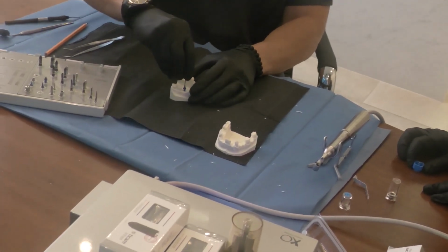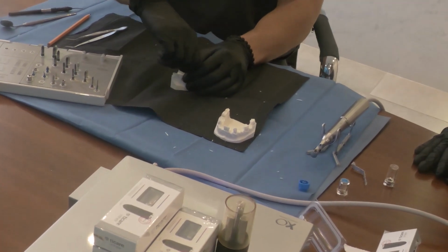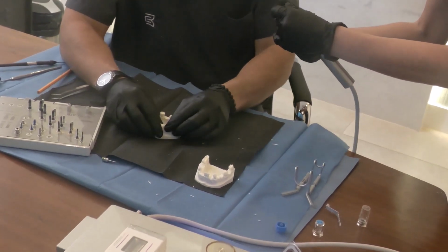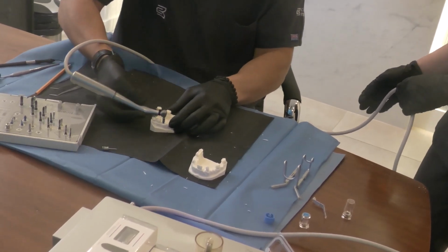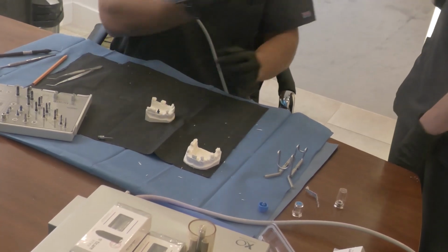You can adjust it, and it's time for you to apply either a higher revolution torque or a higher insertion torque, or even within the same torque, but just submerging it. That's according to the drilling protocol that you have used. You can see that this dental implant is very flexible, okay?